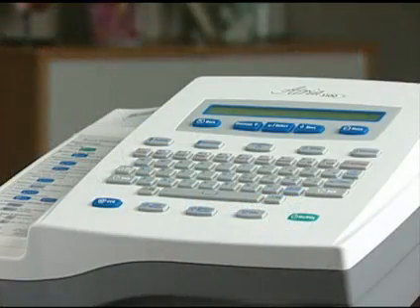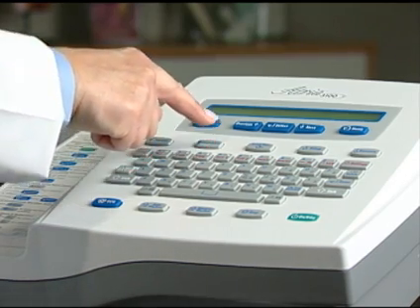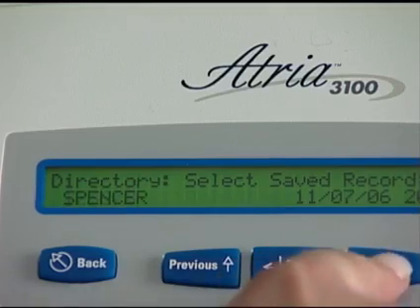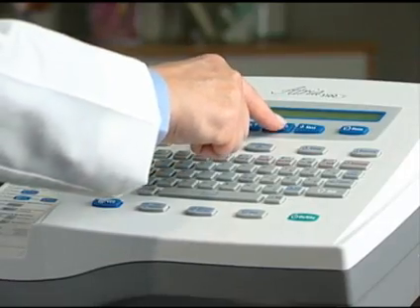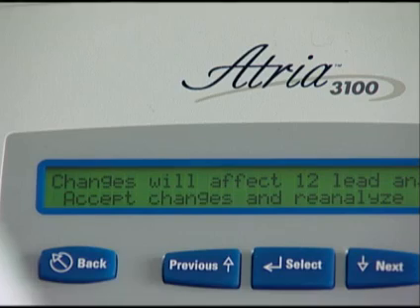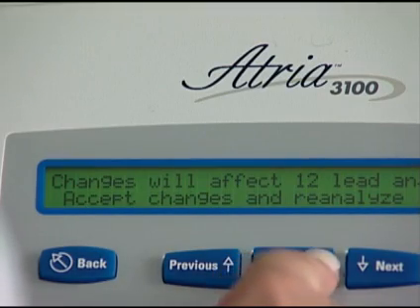To follow up on the report, locate the stat ECG in the directory and enter the patient's data. The Atria 3100 will reanalyze the data using the updated demographics, then generate a new ECG, which may provide a different interpretation. When you see Accept Changes and Reanalyze on the screen, press Select.